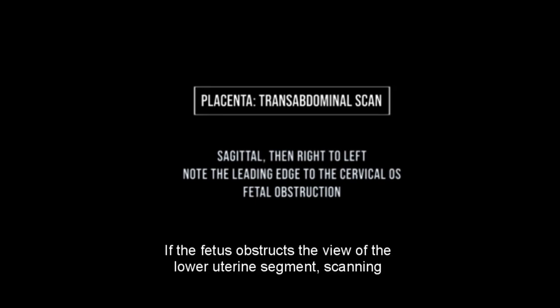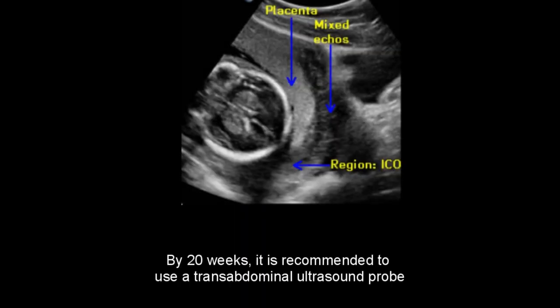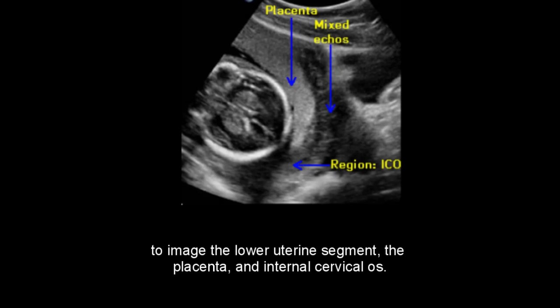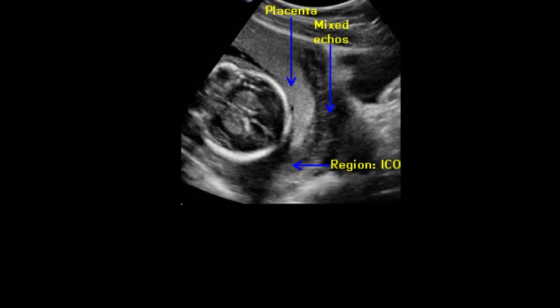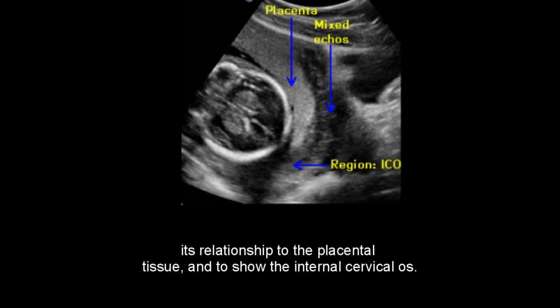If the fetus obstructs the view of the lower uterine segment, scanning laterally may be necessary. By 20 weeks, it is recommended to use a transabdominal ultrasound probe to image the lower uterine segment, the placenta, and internal cervical os. A sagittal view can be used to obtain images of the lower uterine segment and its relationship to the placental tissue, and to show the internal cervical os.